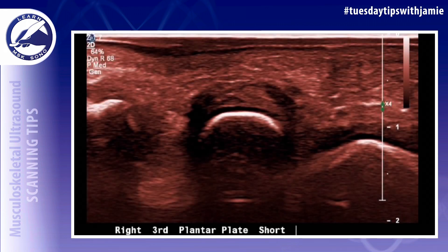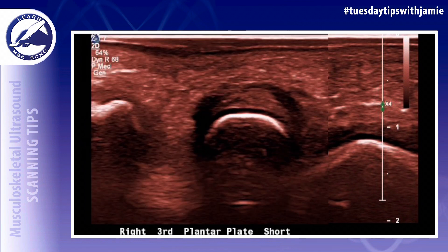Six, take serial consecutive images of the second through fourth plantar plates in the long axis from medial to lateral. Make small movements using the probe. Do not just angle it from medial to lateral.